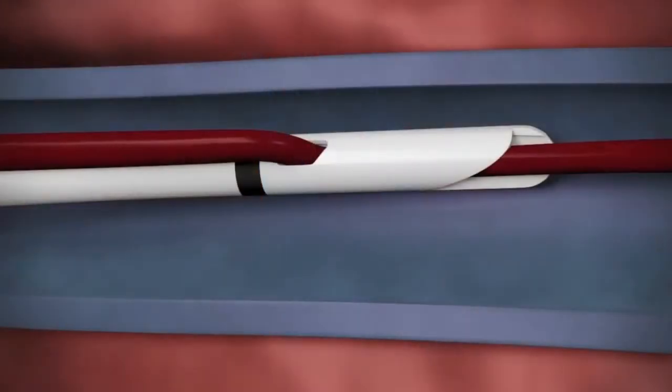The Palindrome Precision Chronic Catheter also features laser-cut side slots, which are designed to reduce the likelihood of clots forming because they have smooth edges and wide openings. The wide openings allow blood to flow into and through the open side slots during treatment, which may further reduce the likelihood of clotting.